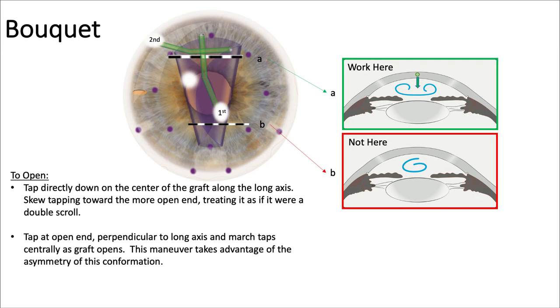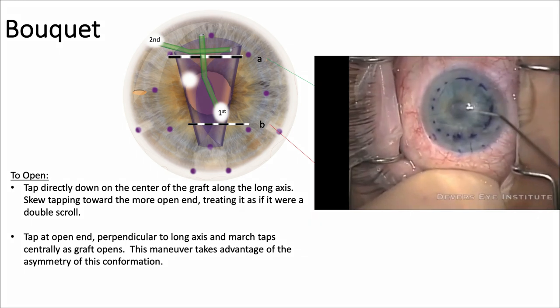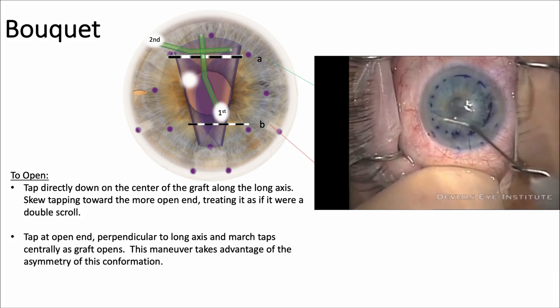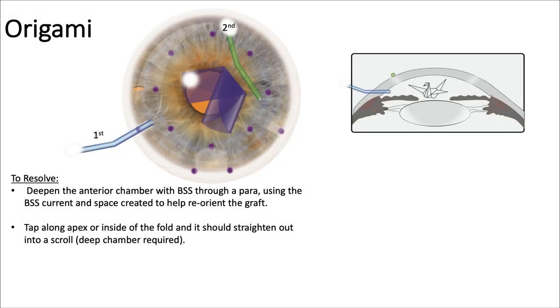The bouquet: it's important to know where to work. You want to work at the open end of the bouquet, not the tightly closed end. Starting there, tap directly down to the center of the graft along that axis, then skewing it towards the open end — this allows a fluid wave to go down there and open it up. Here's a bouquet, and light tapping of the fluid gets those fluid waves across.